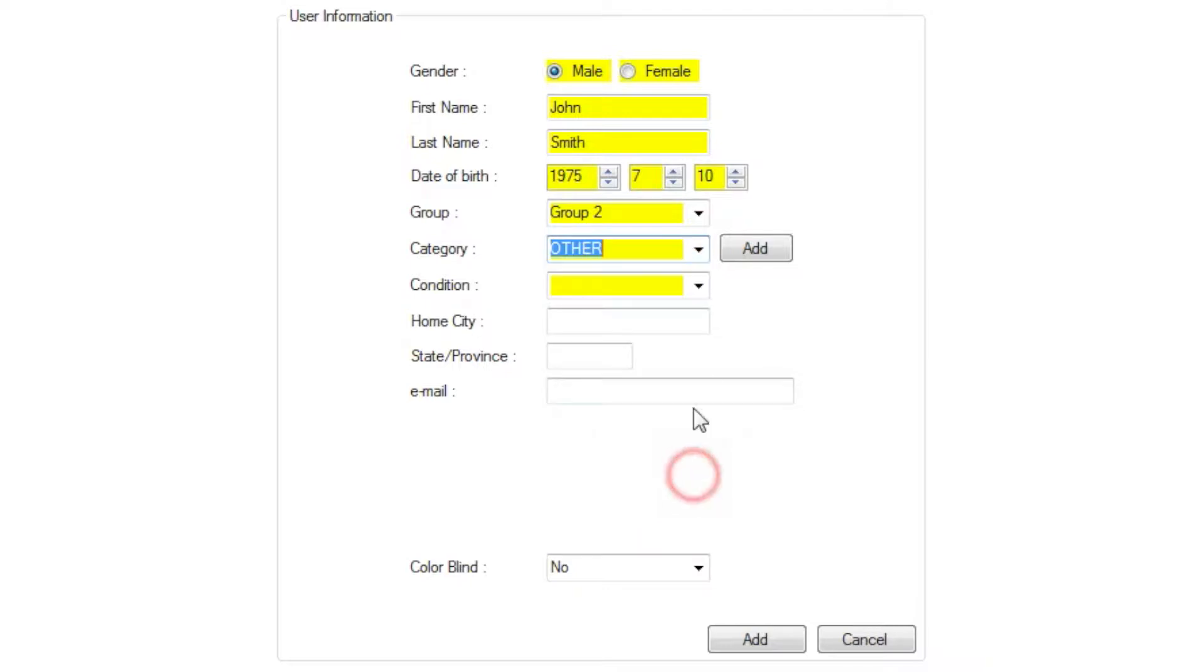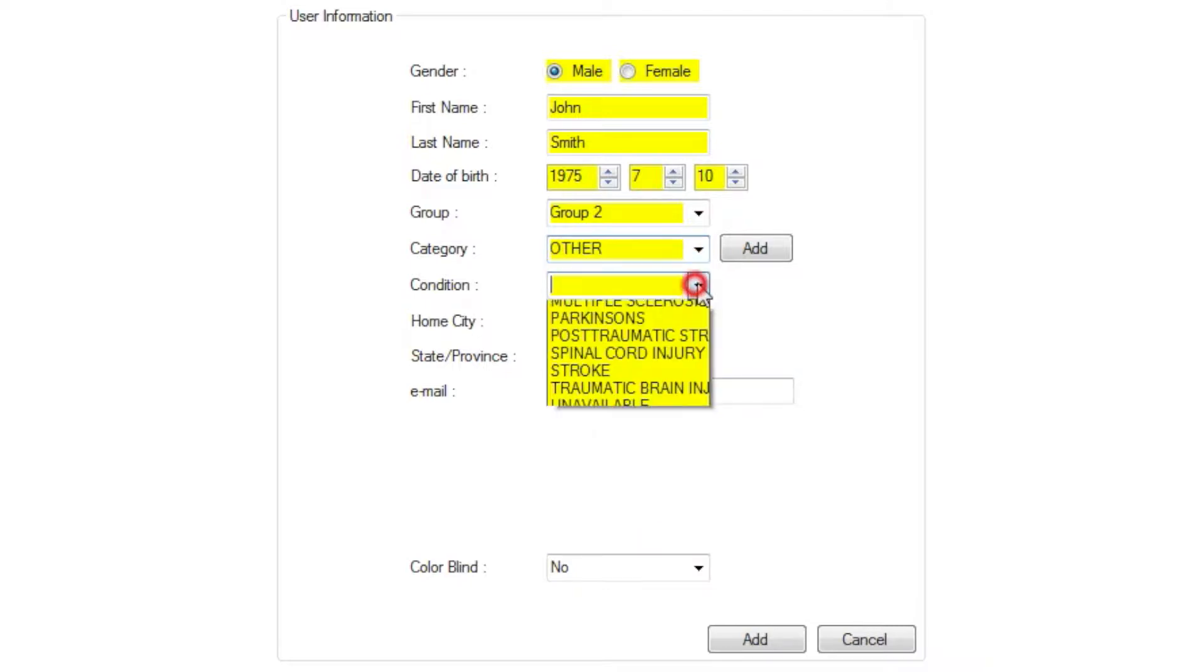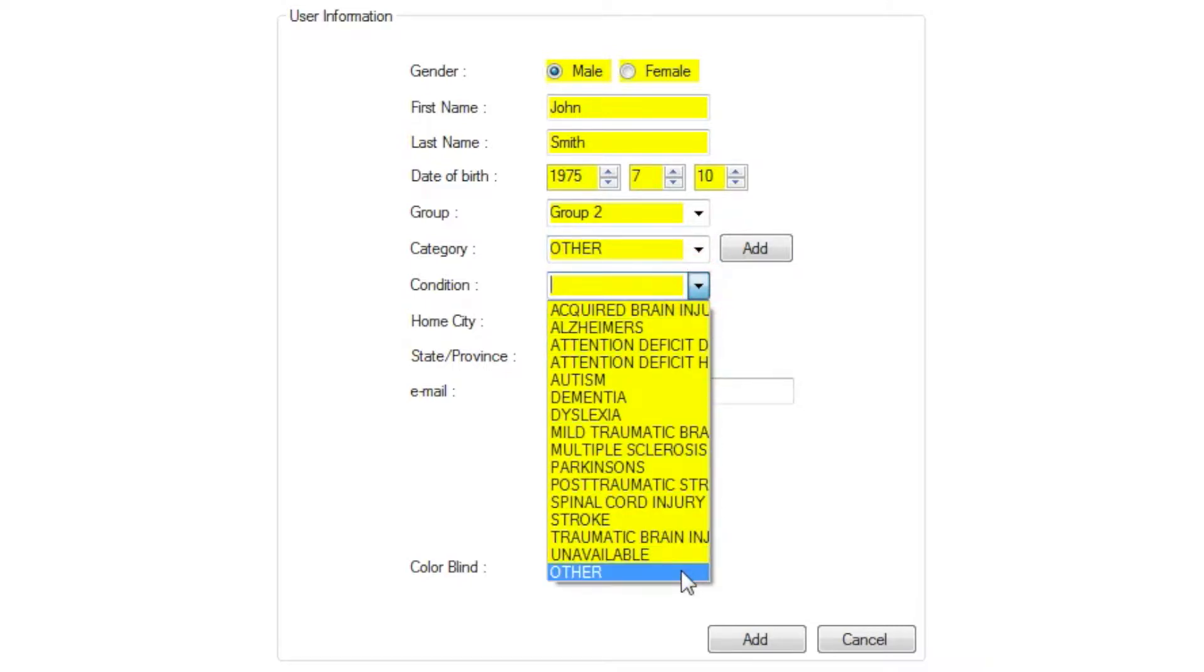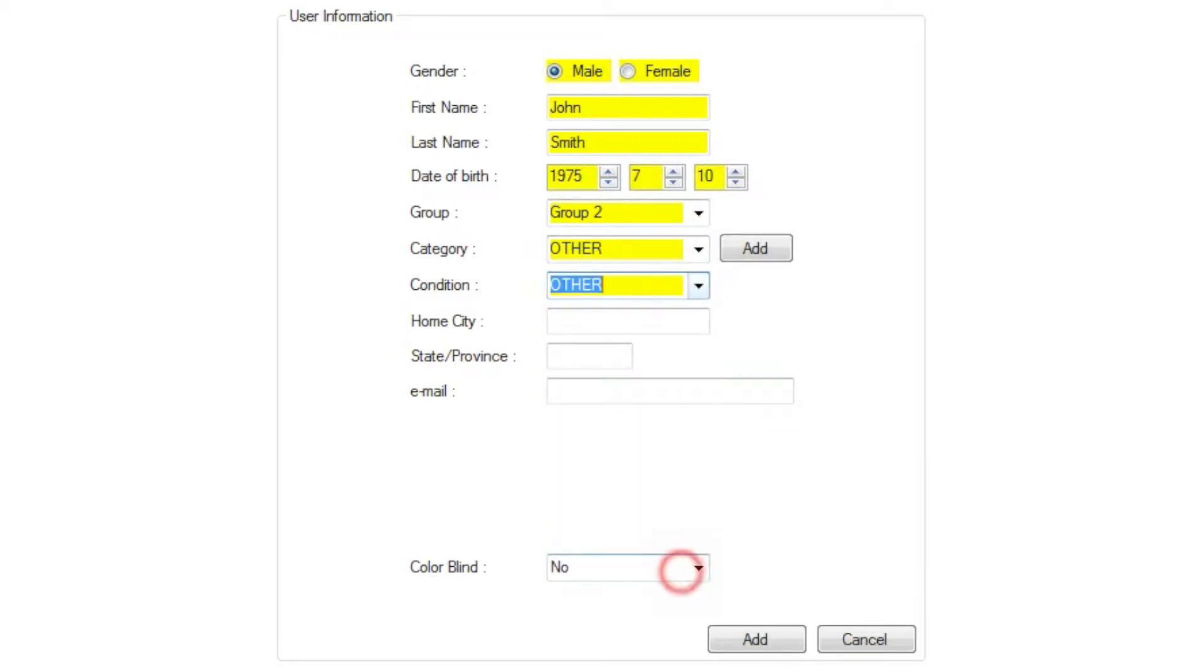Last, specify the user's medical condition, if applicable. If the user does not wish to disclose this information, you can select Other.